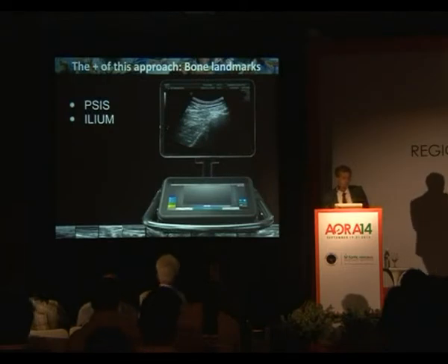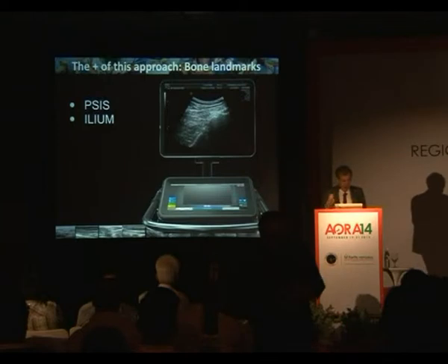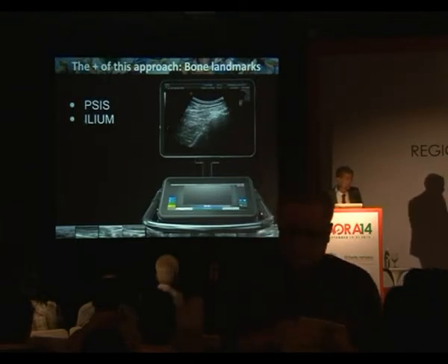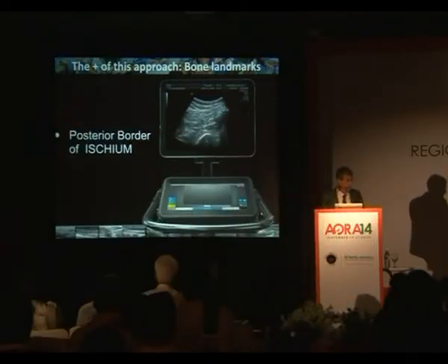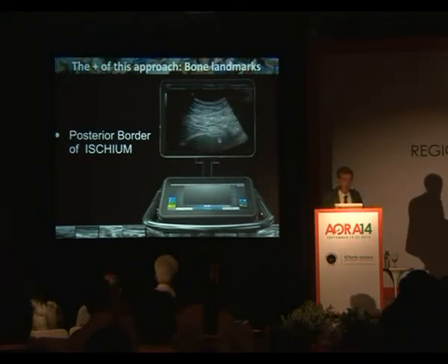So, the plus of this technique, it's very simple. We have the posterior iliac spine. You will see it in any type of patient. We don't need to have an anatomical patient. The ilium is the slope, okay? Then after we will have the second bone landmark, which is the posterior border of the ischium. Then you turn laterally to make this white line horizontal as much as you can, and you will have this image with this pulse. Normally there is a video.